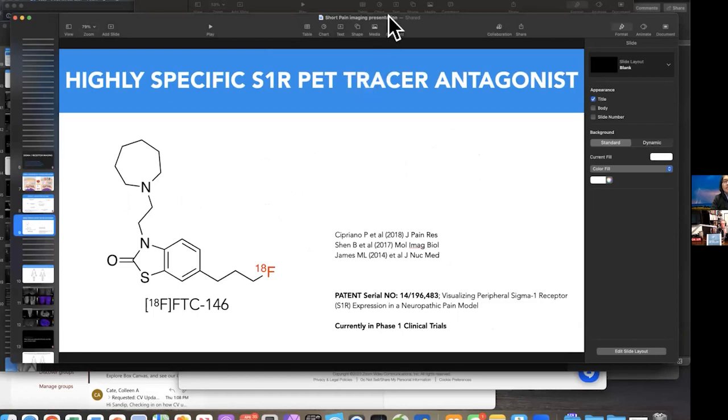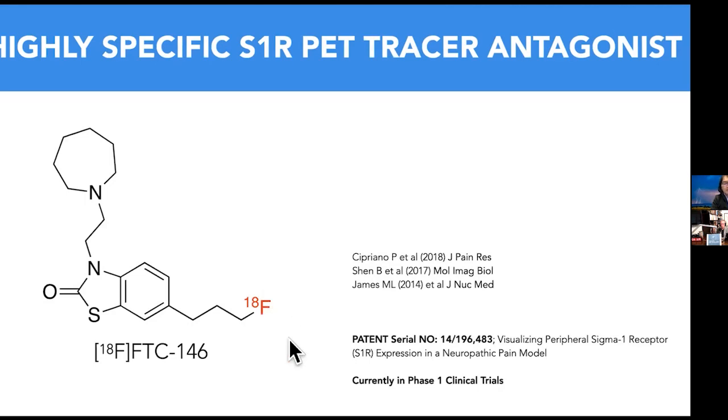Is this the ligand? This is the radioligand, yes. So the cold compound is here, and then we attach this positron emitting isotope. So it is a source of radiation, but we use this radiation to our advantage with what's called a positron emission tomography camera, a PET camera, to identify and localize where this is because of this F18 moiety that's on here. It's a small molecule, it's patented, and it's in clinical trials right now.